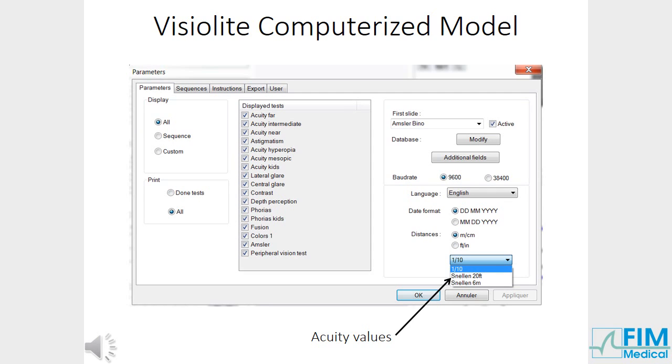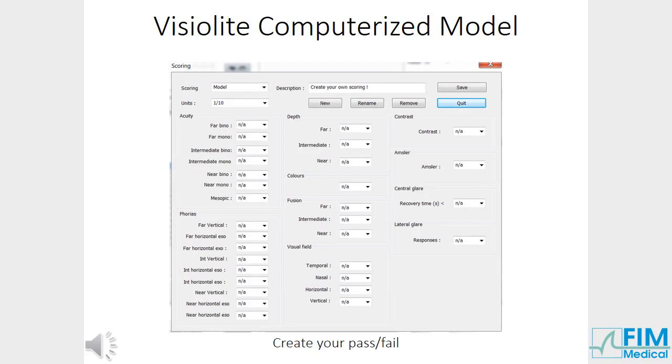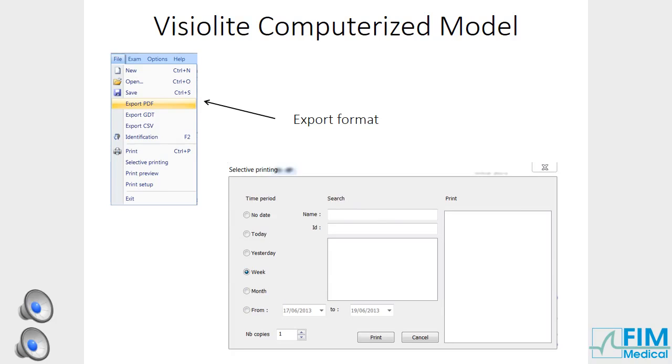Now discover the new features of our software. Select the acuity value as shown. Use our integrated scoring according to Purdue job standards for instant pass or fail test results. Your own scoring can be parametred by entering the minimum and maximum value to determine a pass or fail. To export results, select File and the export format you desire. Results can be exported in PDF, CSV and GDT format.